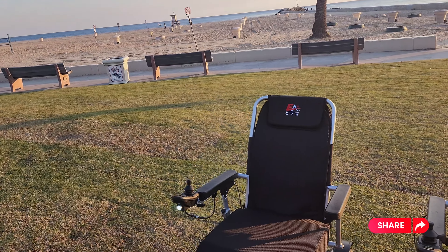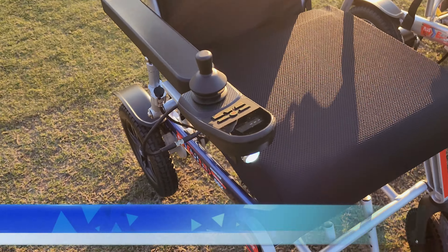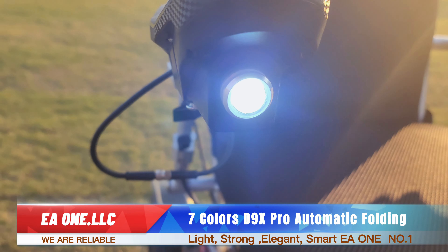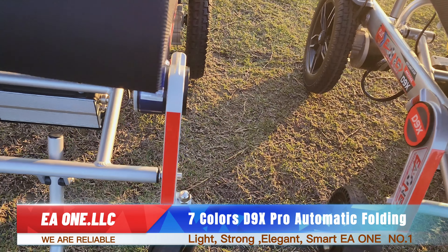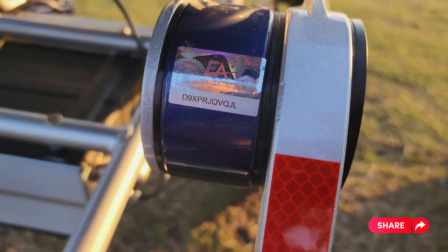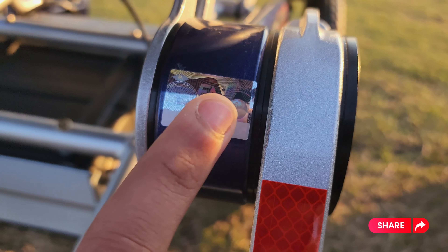Hello, this is the EA1 electric wheelchair. Today we're going to be showing you our exclusive seven-color wheelchairs, their features, and how to know whether your wheelchair is original or not. Firstly, we have the flashlight. We also have these red light stickers.